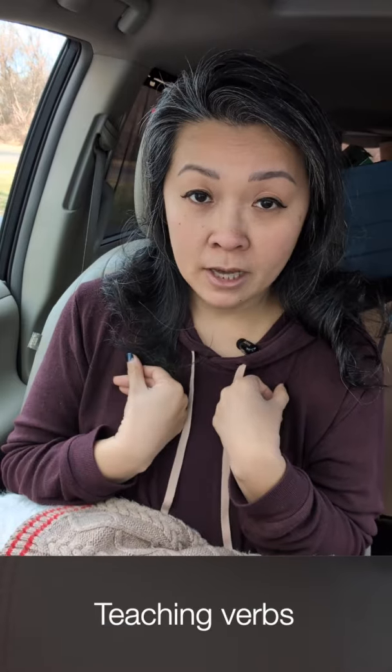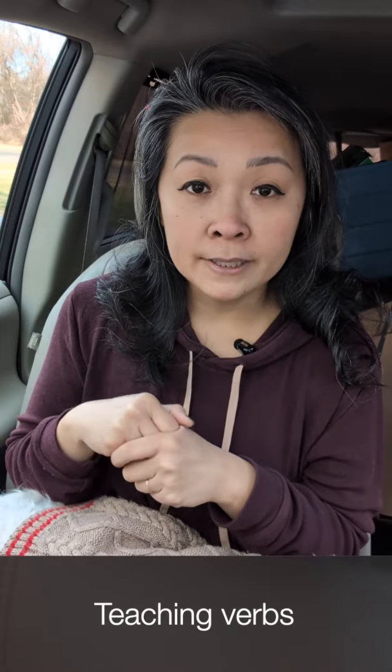For our speech pathologists, we focused a lot on verbs. They are harder to learn, but they're more powerful because you can link nouns to each other. So an example is eat. We would have a plate that had foods that she really likes. I would show her on the device, eat. Then when she would say eat, I would give it to her and I would make sure that she eats. That's how you would teach a verb. Once she got that down, then we would switch it to I eat or mama eat.